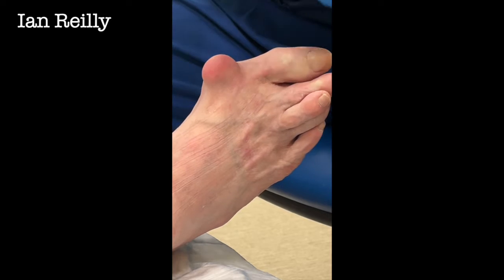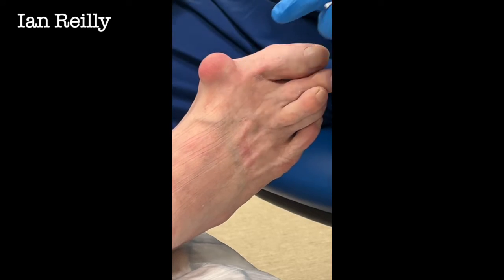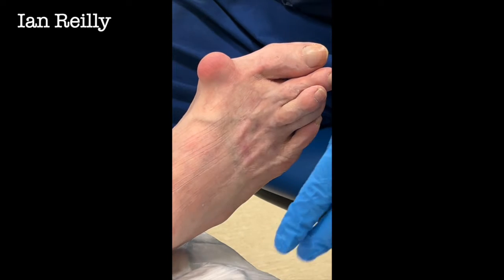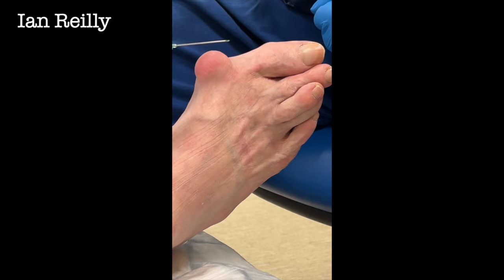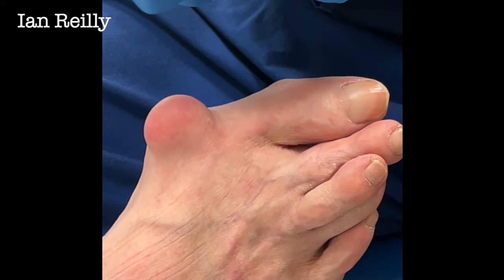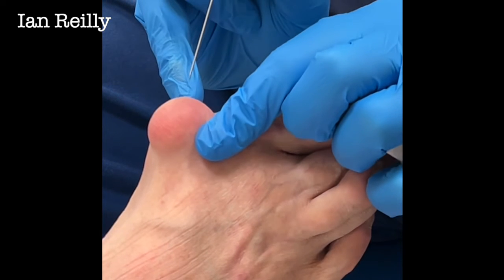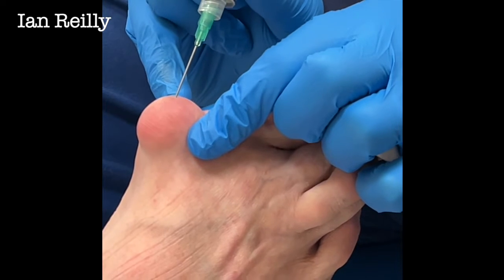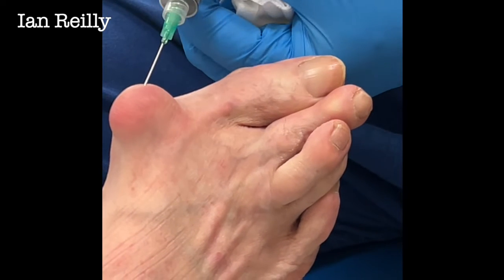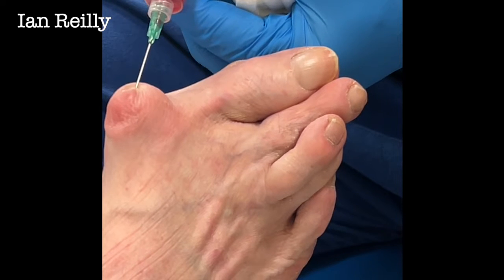So Alan, you've got this quite impressive bursa. We've just cleaned the skin, and we're going to use a green 21-gauge needle — just make sure that's all nice and painted. We're going to see if we can get any juice off this at all. Scratch — Alan, three, two, one — don't pull a face. Let's see what we can get off this. Oh, the answer is quite a bit.